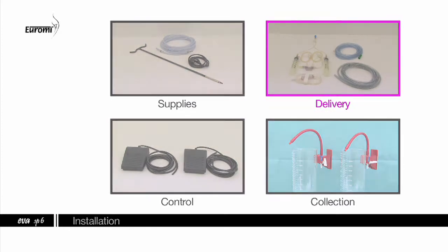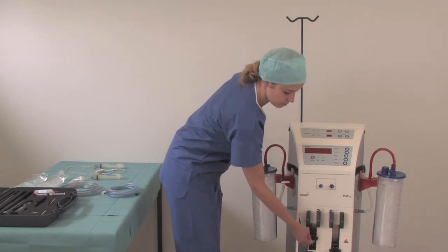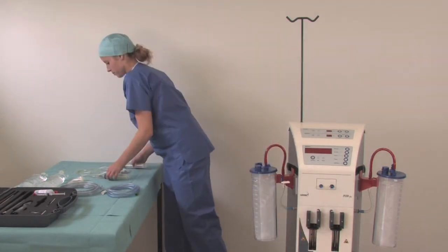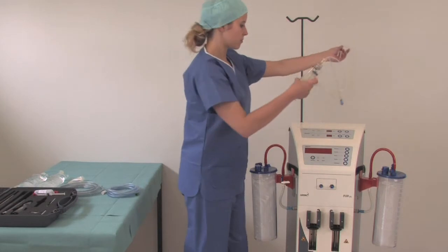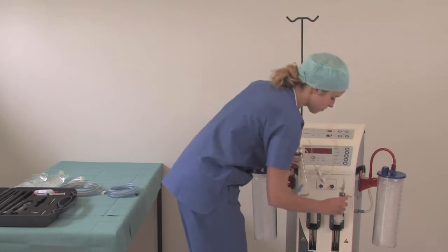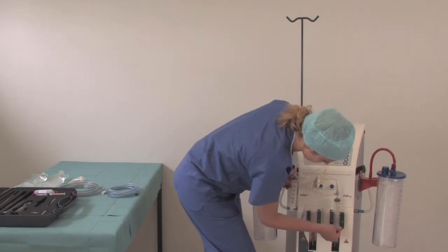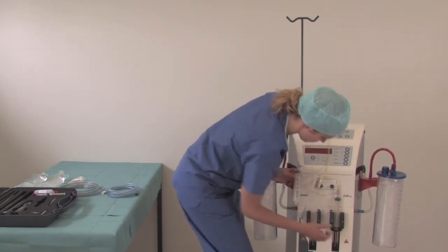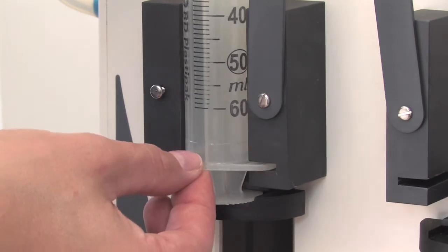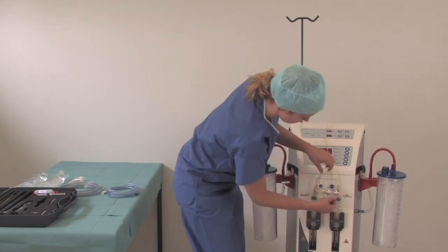Delivery accessories assembling. Open the sliding syringe lock and lift up the push syringe. Infiltration tubings must be placed before switching on the unit. Place the base of the syringe in the slot of the syringe holder by inserting the base of the piston in the slot of the push syringe at the same time. Gently push the syringes in the slot. Close the sliding syringe lock.